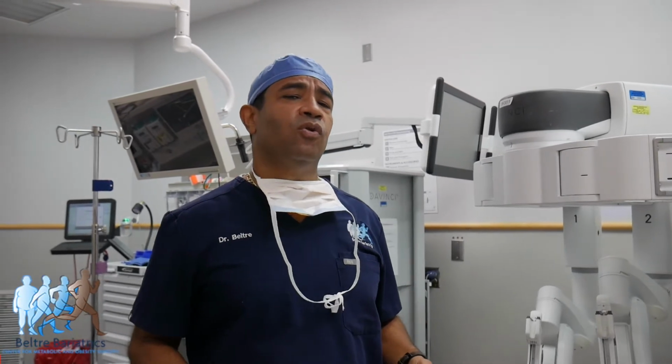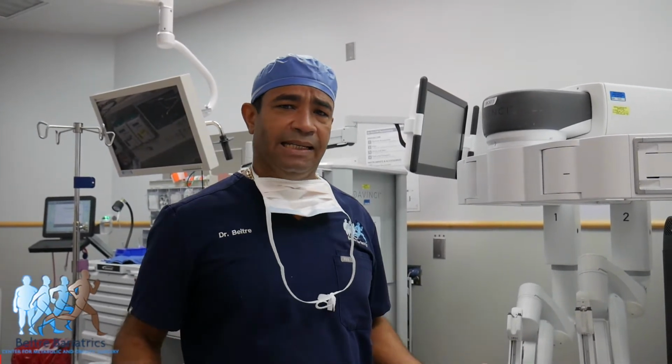We do a lot of robotic surgery these days. I pretty much do all my bariatric procedures in the hospital with a robot. I'm sure you've seen advertisements about it, and I just want to talk about it because some of my patients ask me about the robot. One of the things they ask me is, is the robot doing the surgery? Well, the robot doesn't do any surgery. You can think of the robot as an extension of the surgeon's arm.